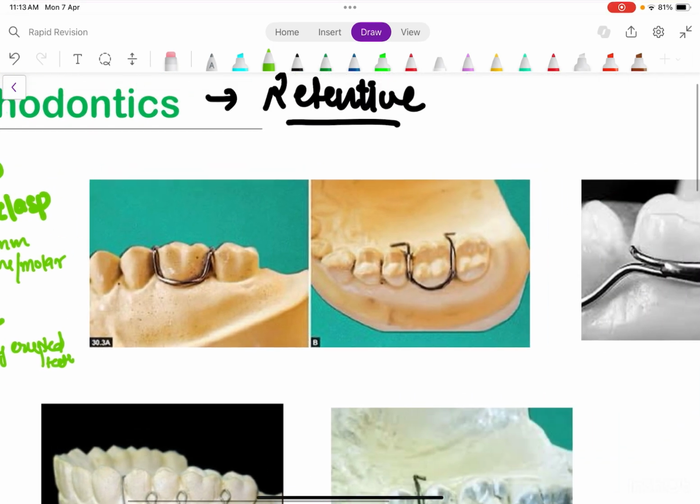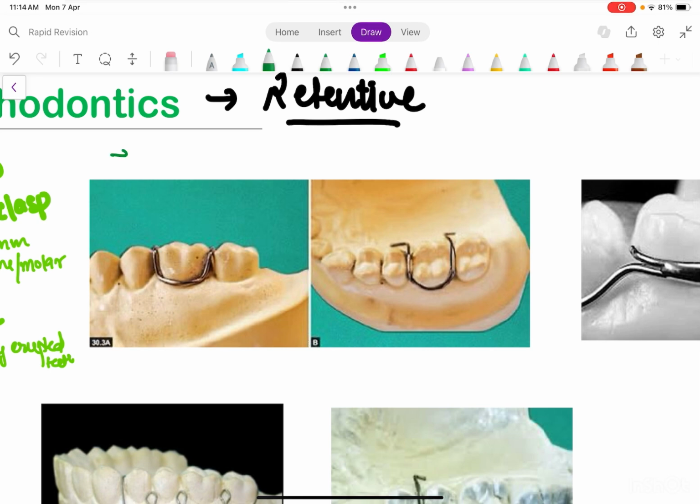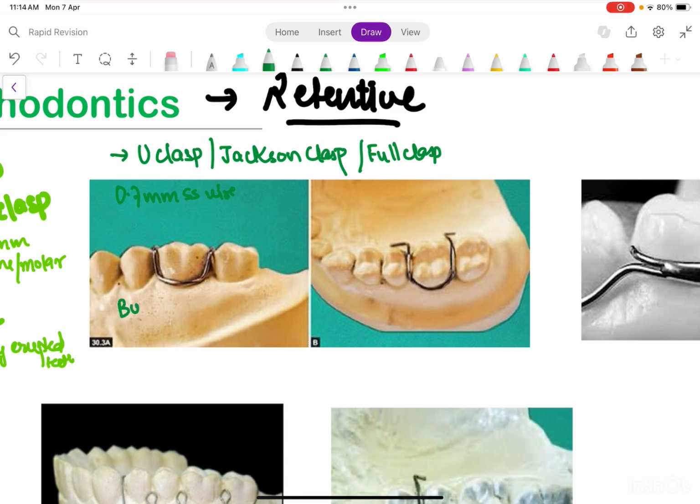Now let's talk about this one. See, this is a total U. C was this and this is total U. So you can call it a U clasp, or you can call it Jackson's clasp because it was given by V.H. Jackson, or you can call it a full clasp. Okay, now this is again made up of 0.7 mm stainless steel wire. Now see, it involves the buccal plus the proximal undercut.